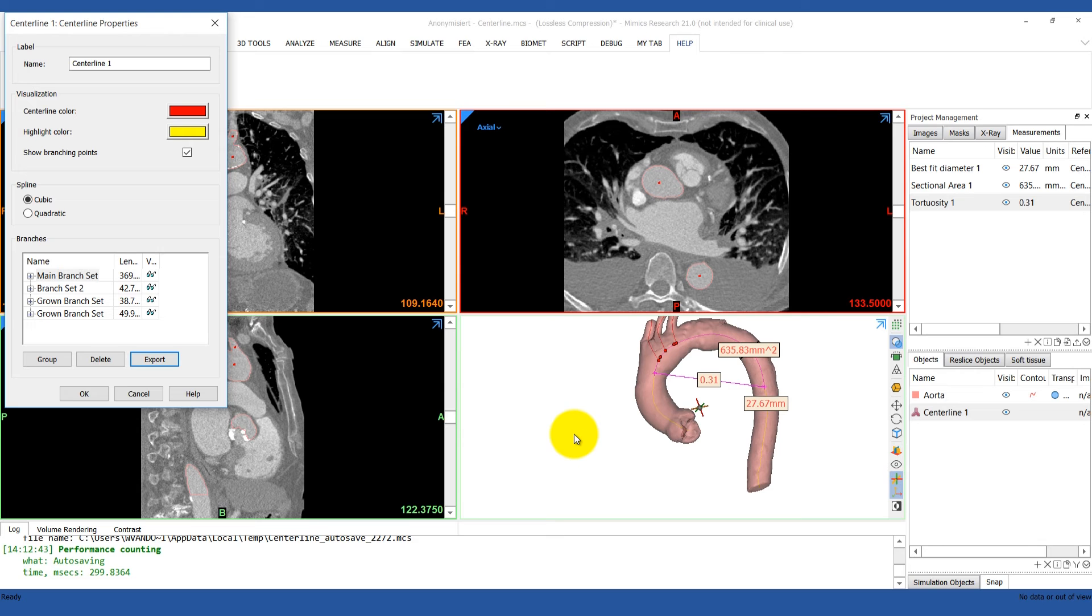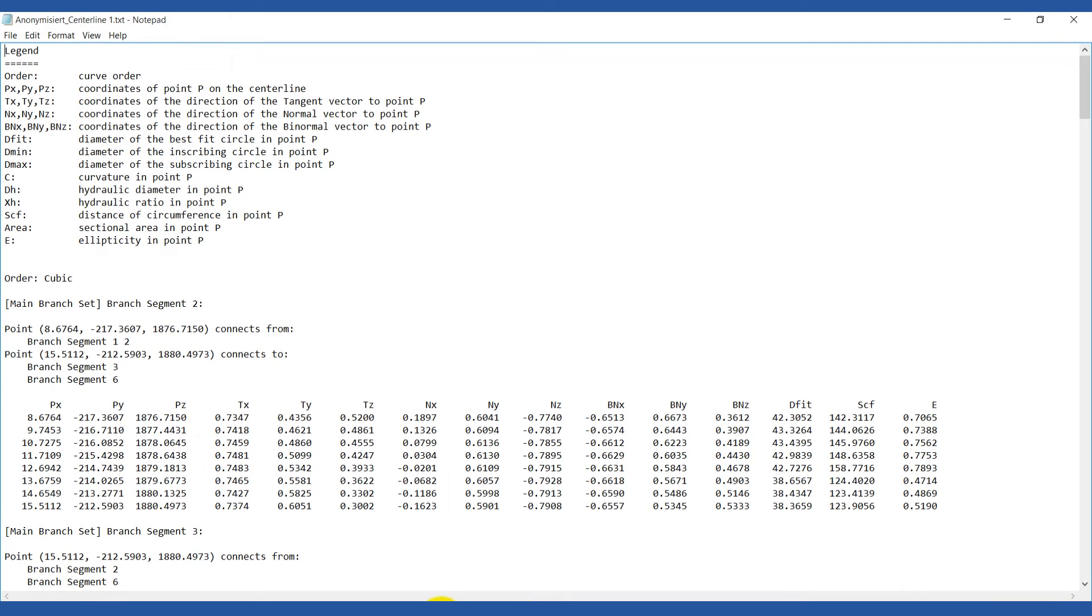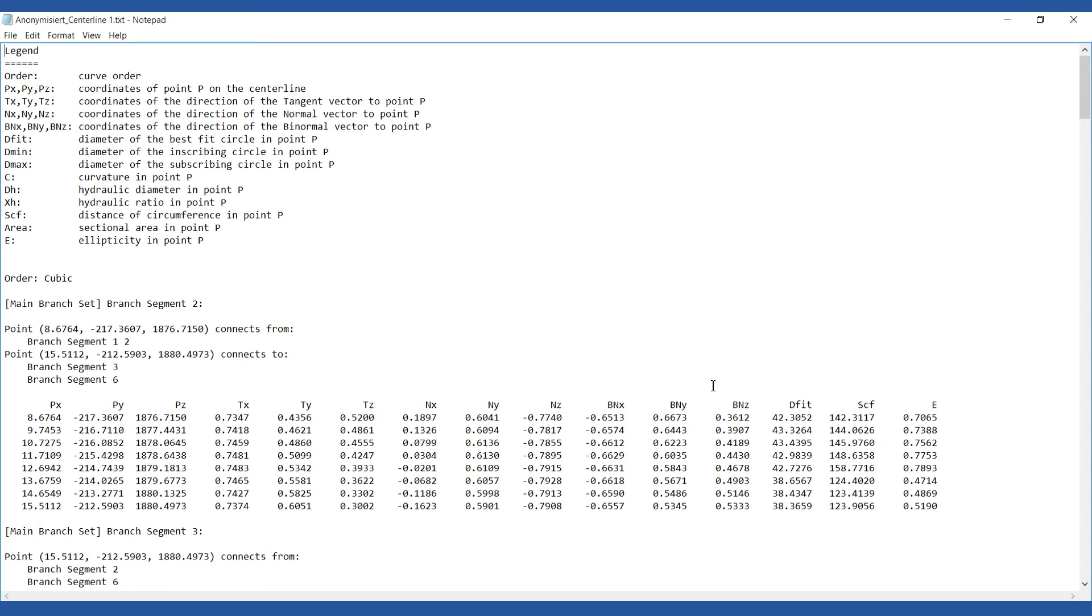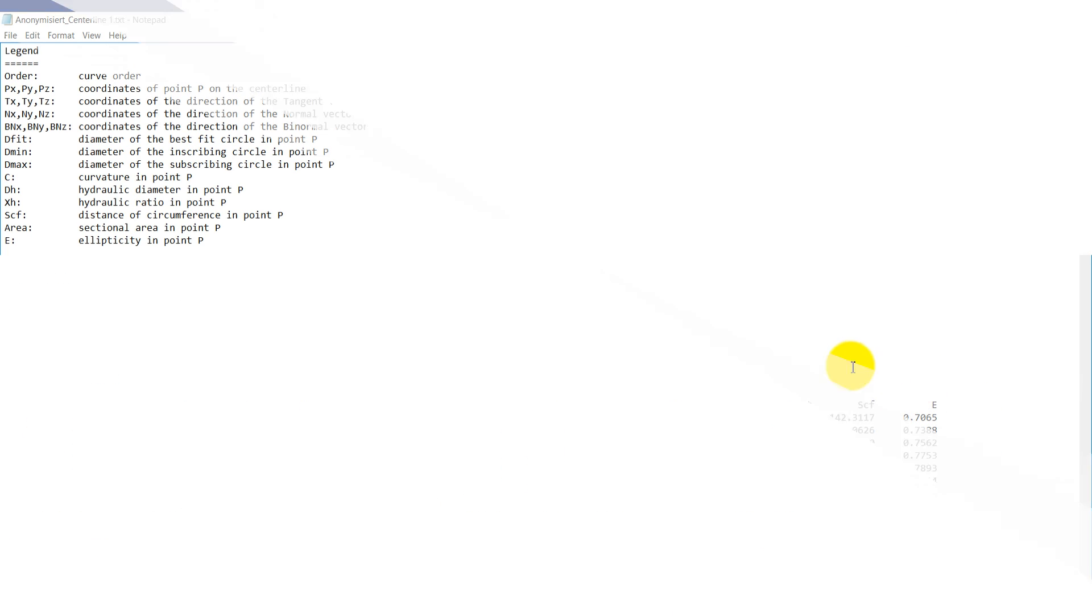If we open up the text file, this is what it looks like. You can see there is a legend at the top to help you decipher that document. It's showing the coordinates, the tangent vector, the normal vector, and the binormal vector of each of the control points, and finally, the desired measurements.